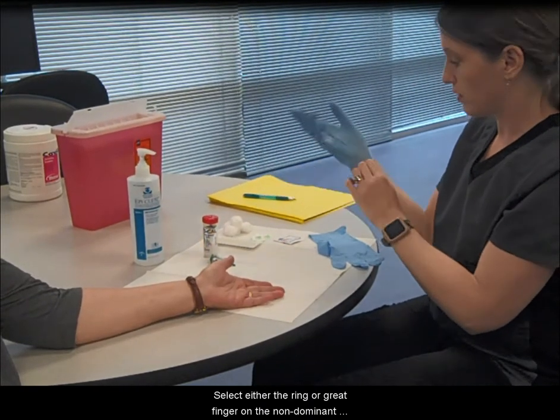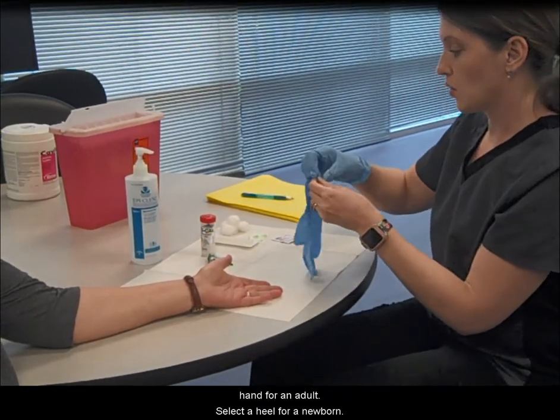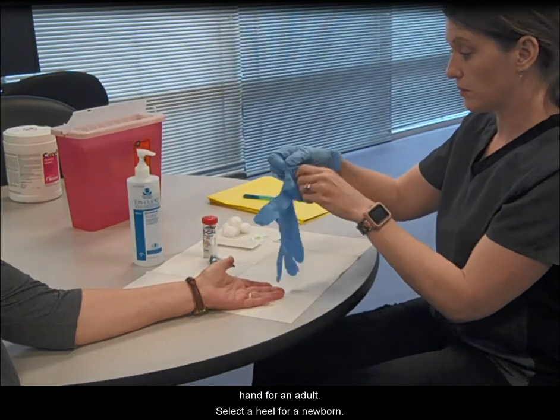Select either the ring or middle finger on the non-dominant hand for an adult. Select a heel for a newborn.